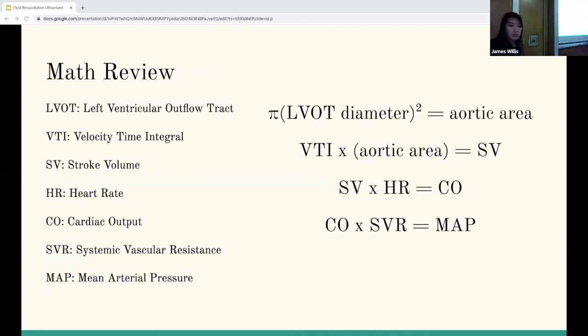Right. But I'm saying the stroke volume changes just with heart rate. Well, stroke volume is how much you can expel with each individual contraction. So the heart rate doesn't matter at all. No. It matters when we get to cardiac output. No, because the slower the heart rate, the higher the diastolic filling. But he's saying the aortic area is not going to change. Yeah, that's a fixed shape. And the stroke volume, then it's really, with the heart rate, you're trying to get to the cardiac output.